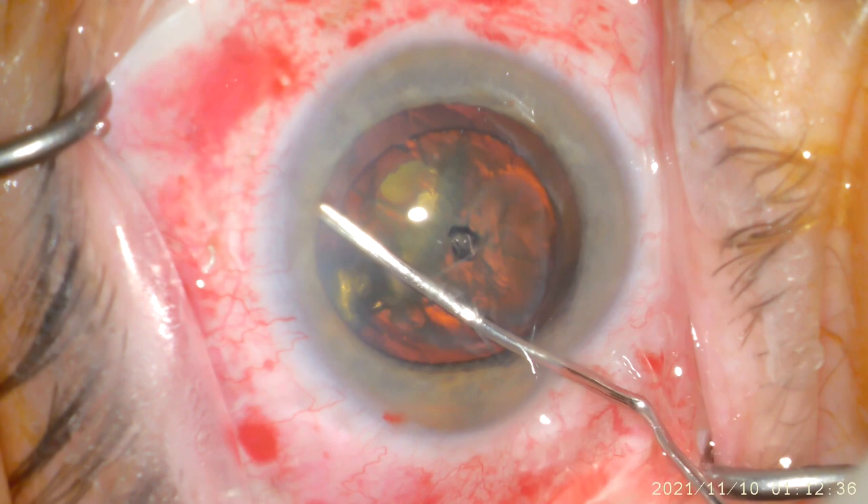As we begin the surgery, I first need to gain access to the natural lens, aka the cataract, with the instruments that you see here.